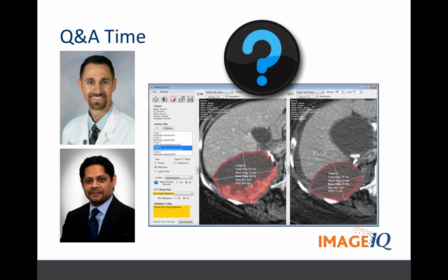That reminds me, Tim, that brings up a good point. I forgot to mention earlier that this tool is actually applicable to contrast enhanced and non-contrast enhanced. It actually works with that. We define the thresholds differently, but the same concept works. And we've even had cases where the first scan is contrast and the second non-contrast, or vice versa. And it does quite well in those situations. So it is a broadly applicable tool.